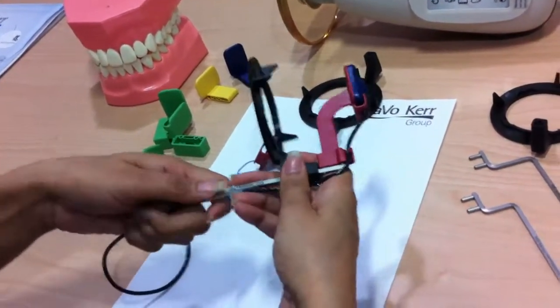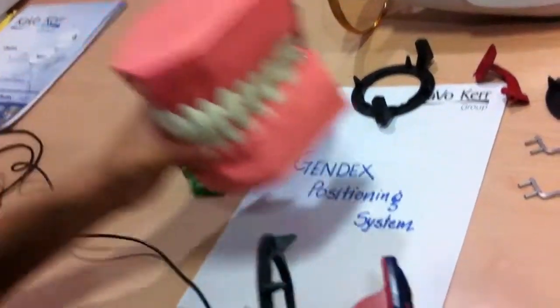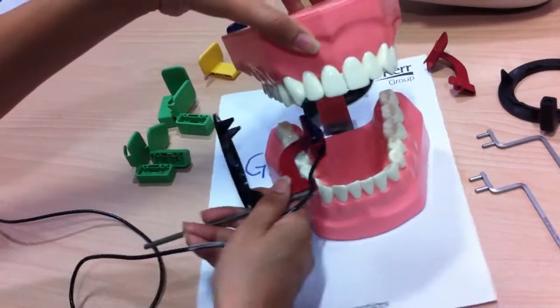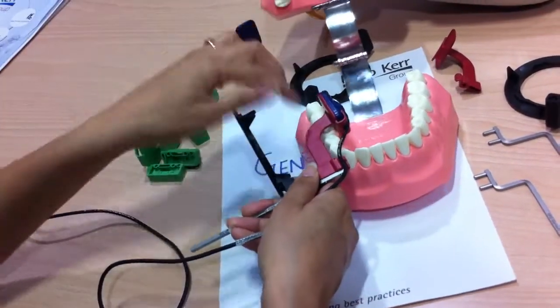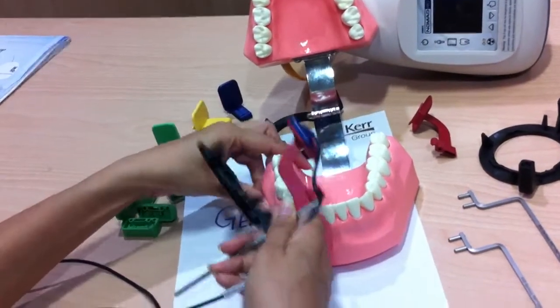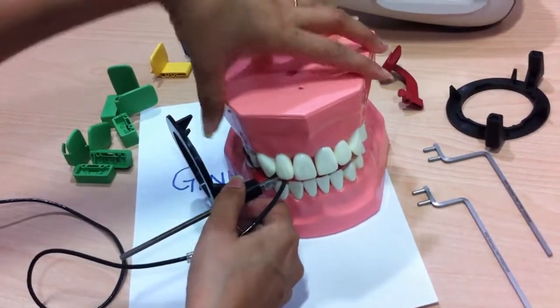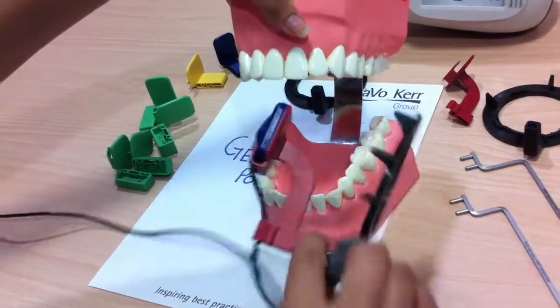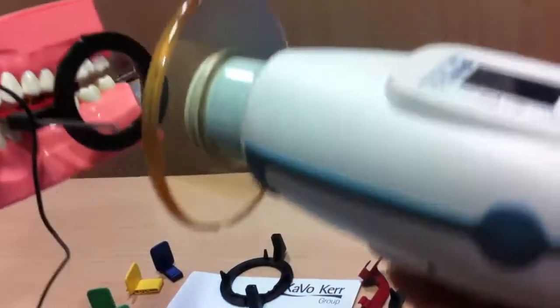We are all set to take our bite-wing X-ray. We need to align the sensor and the positioner, and the patient needs to bite on this surface. This works for both the right side and the left side. The X-ray tube aims into the aiming ring like this.